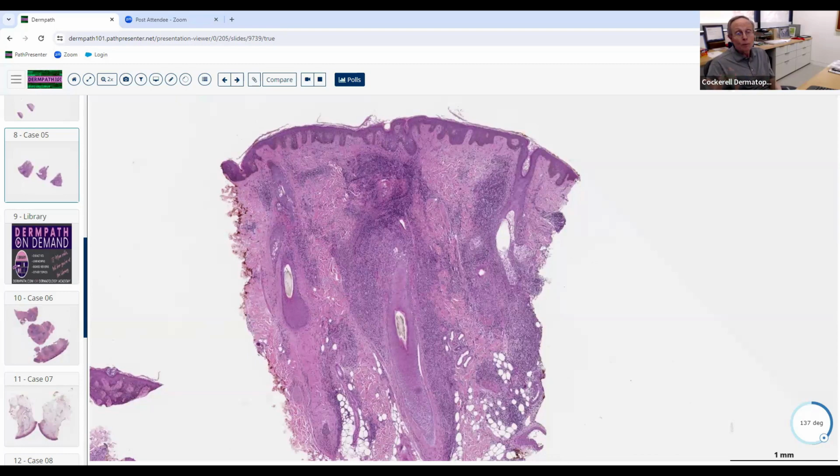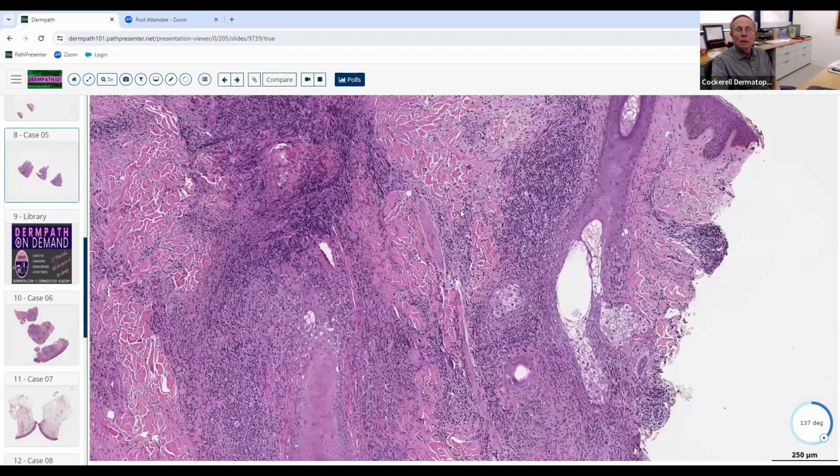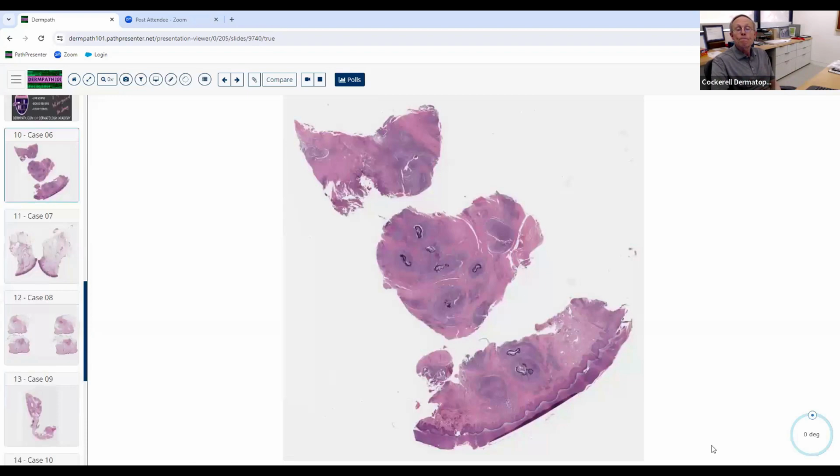That's where the inflammation of central centrifugal alopecia and frontal fibrosing alopecia goes. That's why I think that they're kind of all related, because histologically they all look very similar. But DLE or lupus alopecia goes deeper. It goes way down in here, and it's got the mucin that we saw. So good. This is an example of lupus alopecia, and possibly this sort of systemic alopecia.